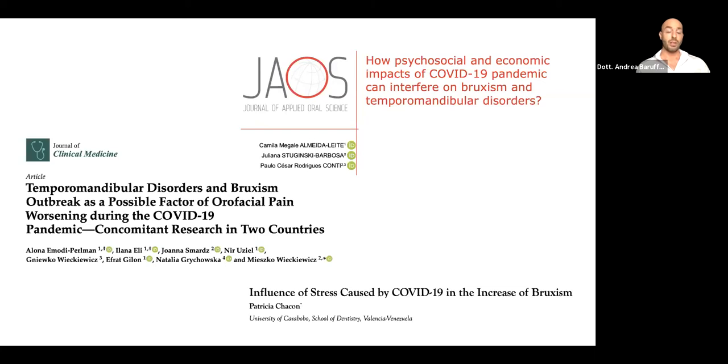The pandemic doubled or tripled the patients with TMJ disorder. So it is important to have some instruments to diagnose this type of problem early, and to make the patient realize that this problem is real and can be read by a simple computer.